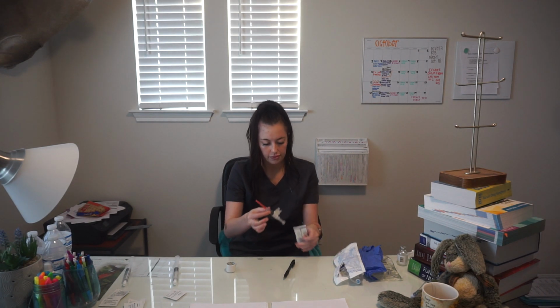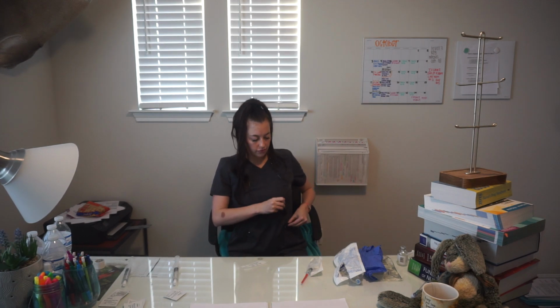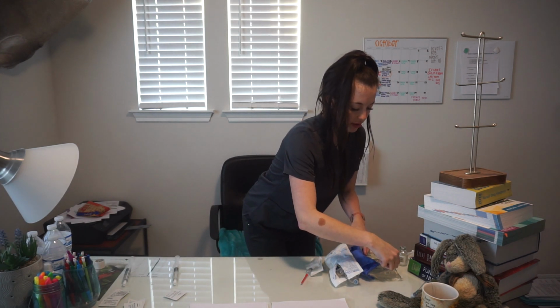And then we have D5 half normal saline at 100 mLs per hour with my initials. I'll put that on the tubing when I get in the room.